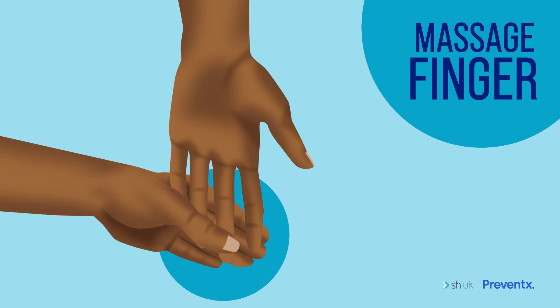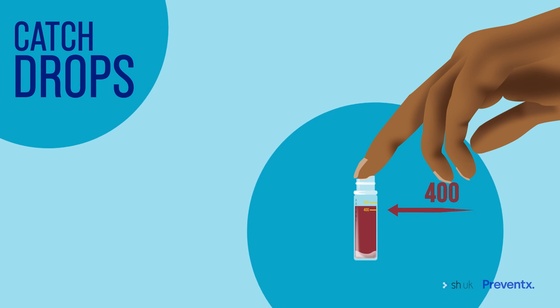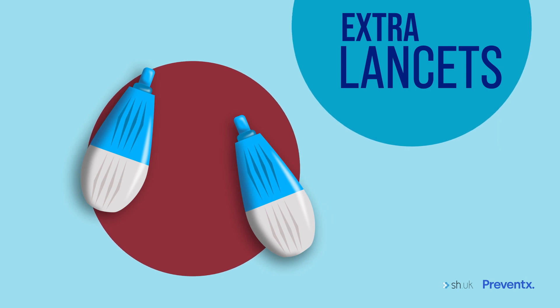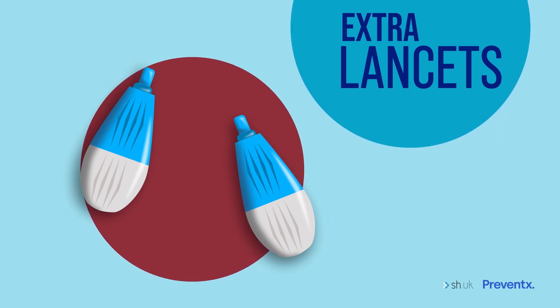It can take a little while to get enough blood. Once blood is flowing, carefully catch the drops in the collection tube. Try to fill the tube until it reaches the top line, which is about 15 drops of blood. Don't worry if you can't quite reach the top line — we can still do most tests if the blood is past the lower line, marked 400. It's okay if you find it hard to catch enough blood; there are extra lancets in your kit. Take a breather and then try again with a new lancet on a different finger to keep collecting blood in the tube.